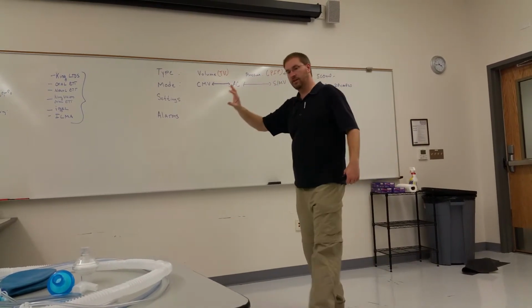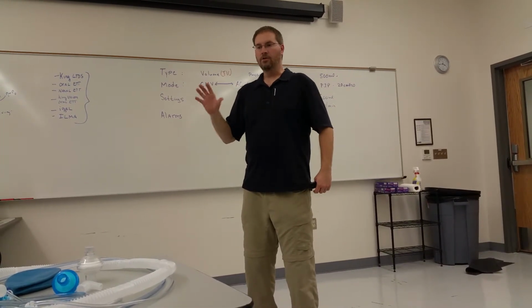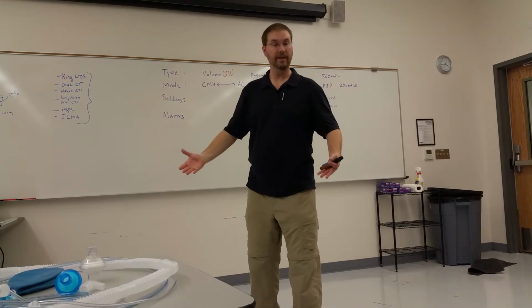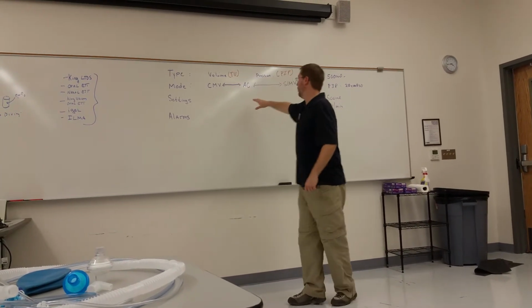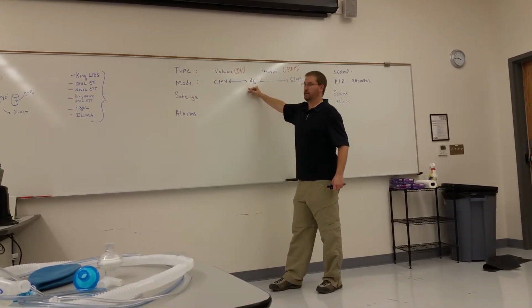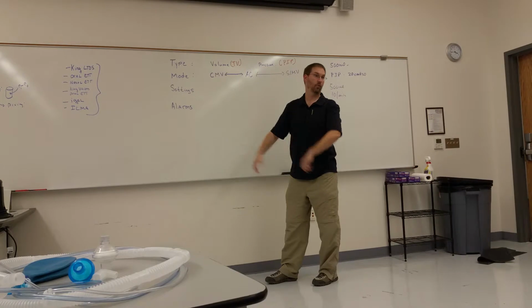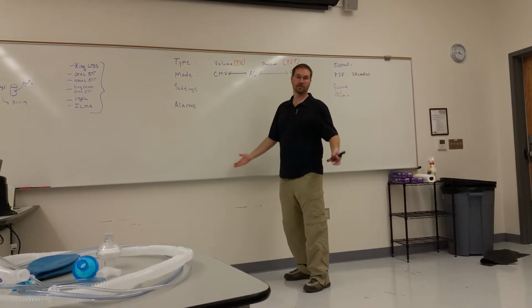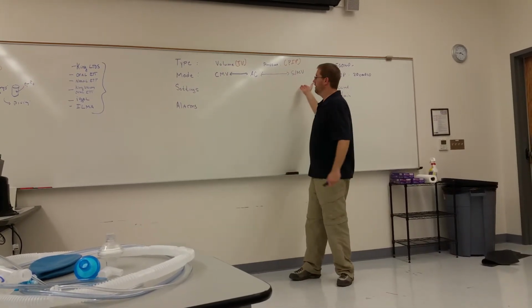But let's say that I have a patient in severe respiratory distress, like a COPD exacerbation, and you intubated them. Do you think putting them in a mode that's going to make them take spontaneous breaths will be all that helpful? No, because why do we intubate them? Because they're not breathing effectively, right? So you probably would want to go with something like assist control in your more critical patients with these breathing patterns that need support. Because the ventilator senses that when the patient's trying to take a breath, and it says, here, I'm going to give you this breath so you don't have to work to take it. Does that make sense? And CMV is really only if you have an unresponsive apneic patient that isn't interacting at all. You guys good with that? All right. That's my mode.